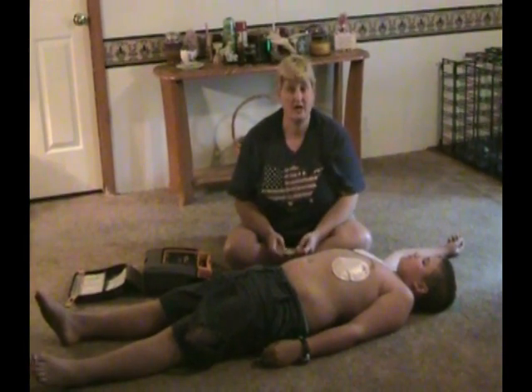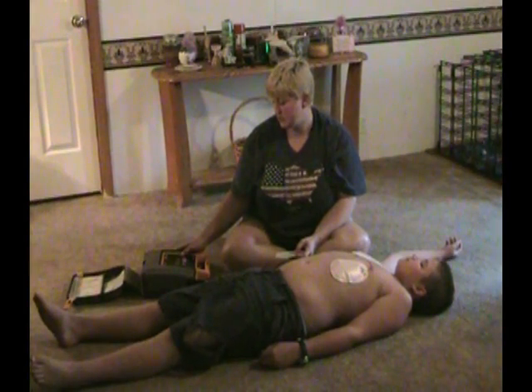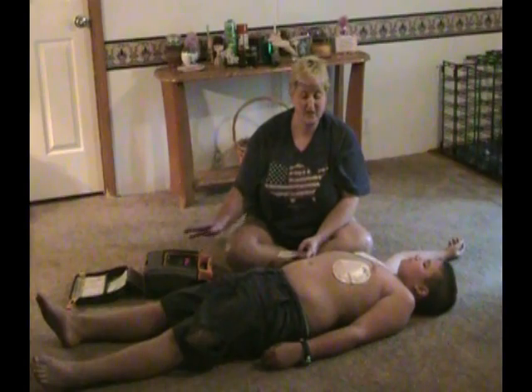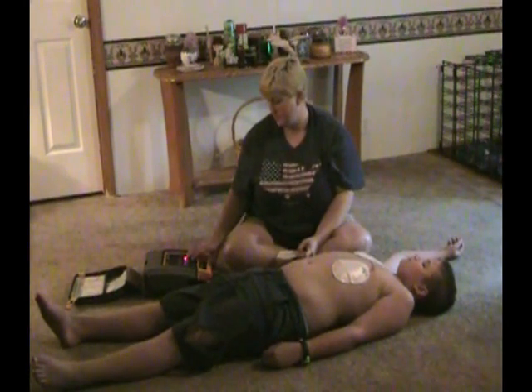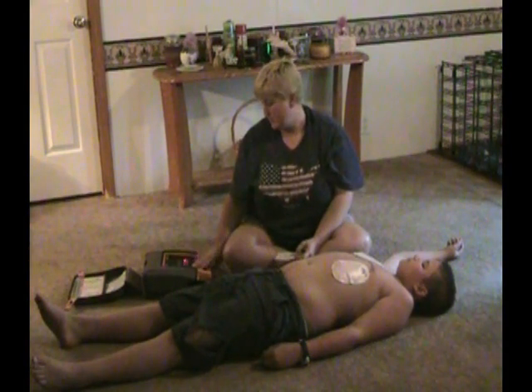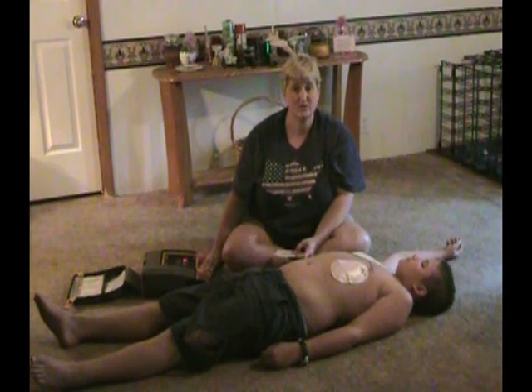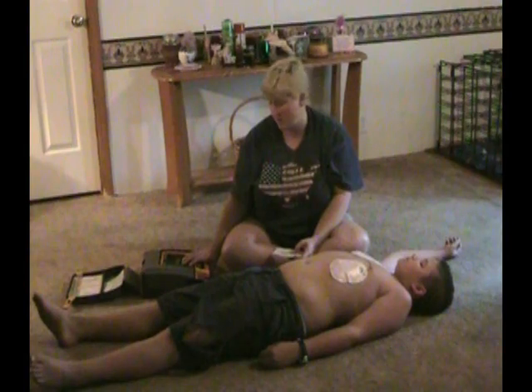It's giving us the shock advised message. It is charging up. Stand clear. Make sure nobody's touching the victim or they can be shocked as well. And the pads delivered a shock. Now it's advising us to analyze again to see what the heart rhythm is after the shock.